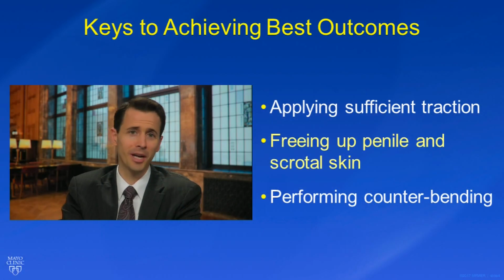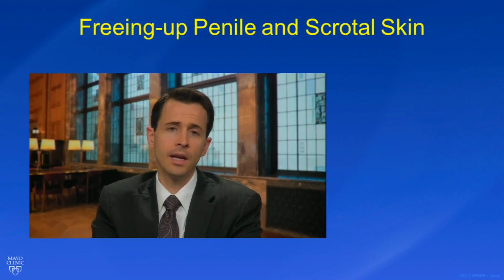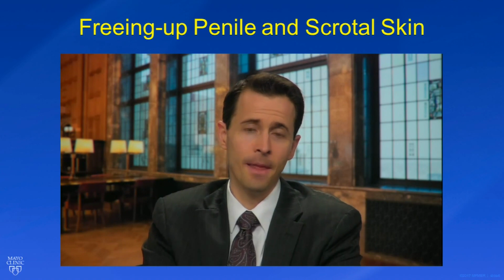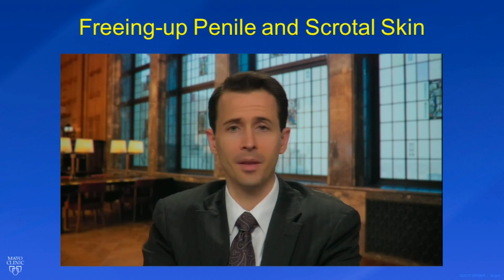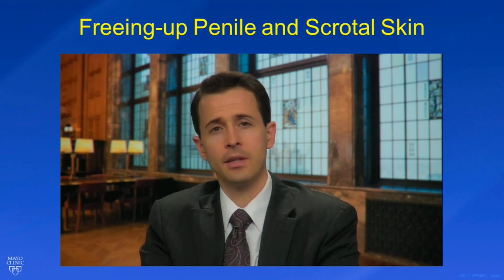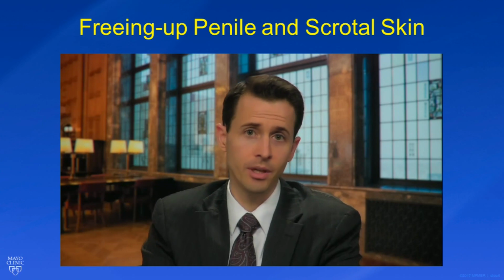Number 2, applying traction to the penis itself rather than to penile skin. One of the most common errors that I see is that people will unknowingly be applying traction to the penile skin rather than the penis itself. This is probably the most common thing we find in men who report that they don't see any improvement in restoring lost length with Peyronie's disease.